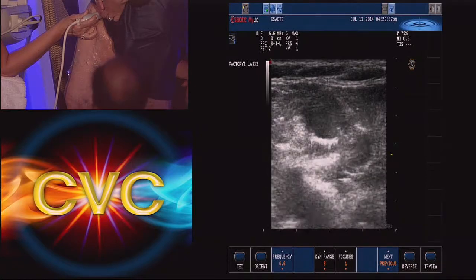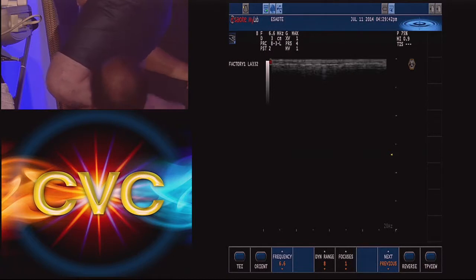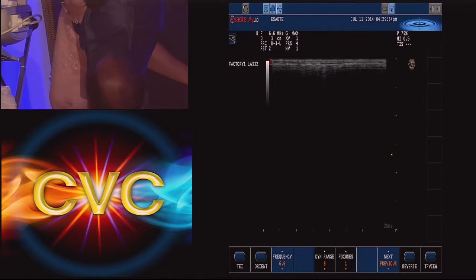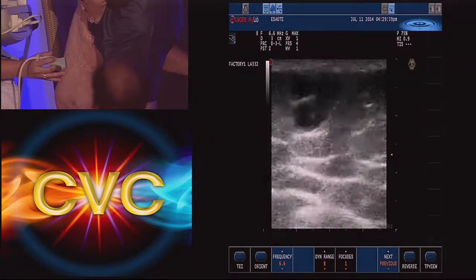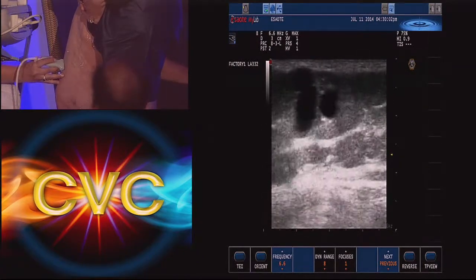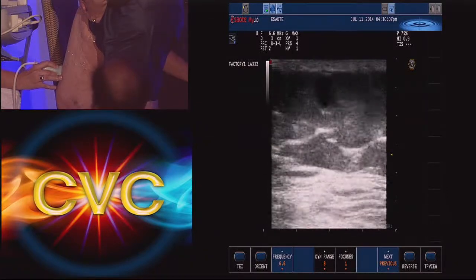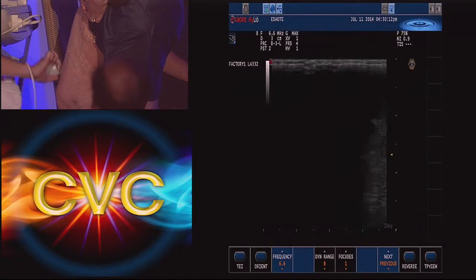No, so this is the point of junctional reflux. It is from the common femoral, through the saphenofemoral junction, into the saphenous vein. But that saphenous vein is incompetent for a short distance, then it's competent underneath. It's normal. Why do you want to burn it? Nope, who told you that? Go hit him on the back of the head a couple of times. It's a normal vein. Why would you shut a normal vein down? So when it becomes incompetent, we'll treat it.